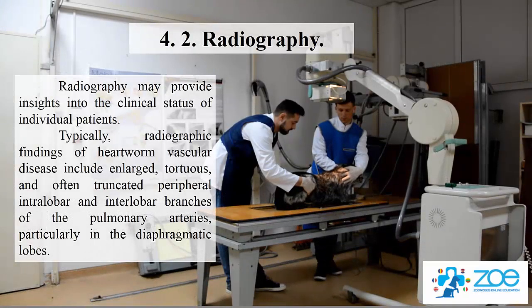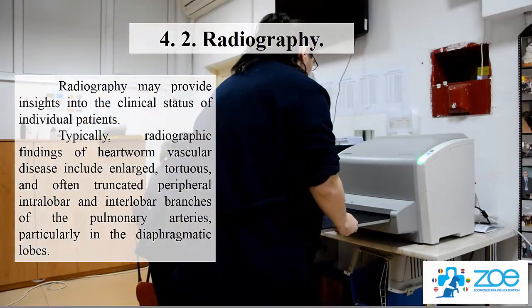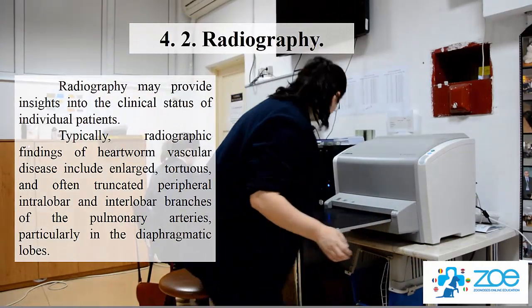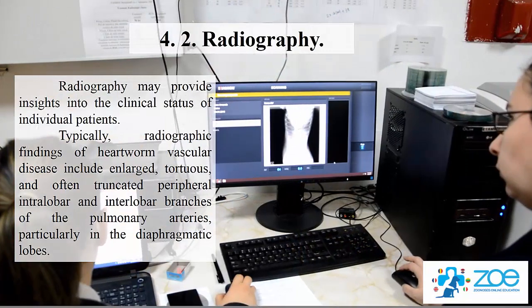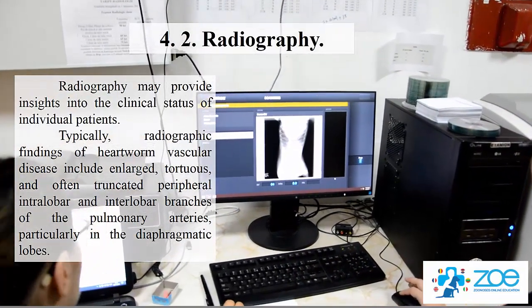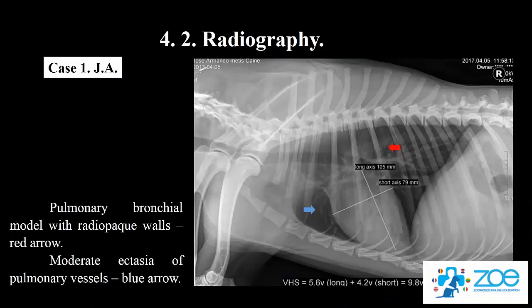Radiography. Radiography may provide insights into the clinical status of individual patients. Typically, radiographic findings of heartworm vascular disease include enlarged, tortuous, and often truncated peripheral intralobar and interlobar branches of the pulmonary arteries, particularly in the diaphragmatic lobes.